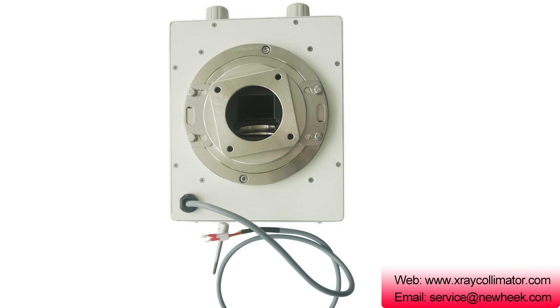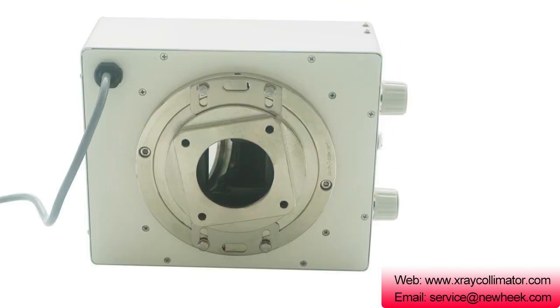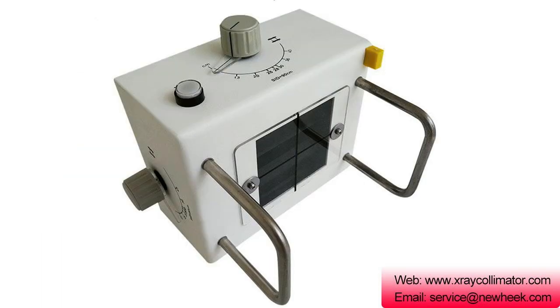It can also absorb some scattered rays to improve image quality. In addition, a light bulb with an LED lamp or a halogen lamp is installed inside the X-ray collimator as an analog light to simulate the size of the projection center and the projected field of view.